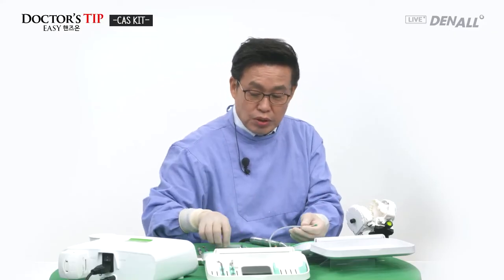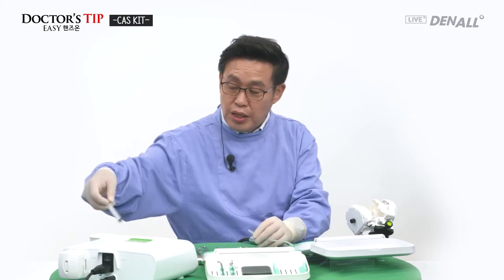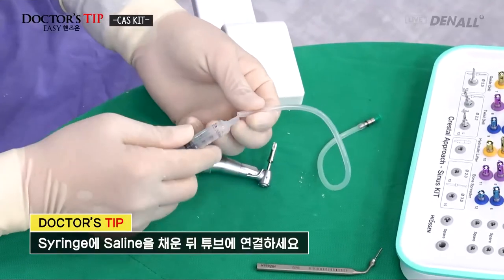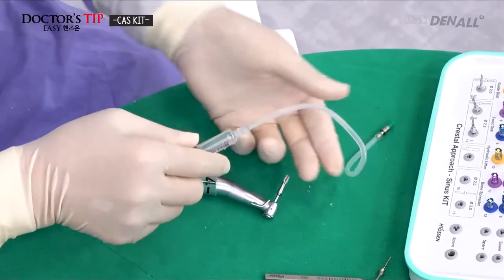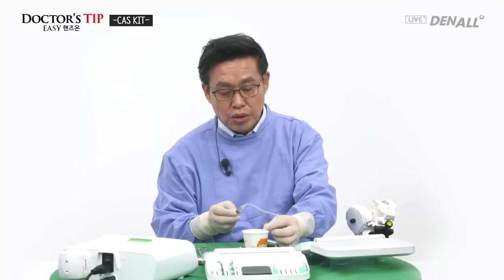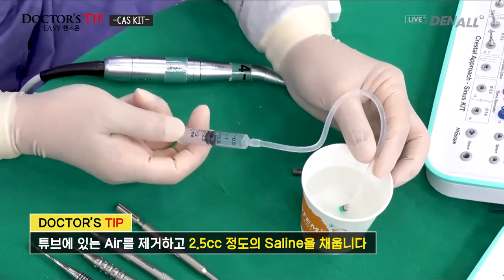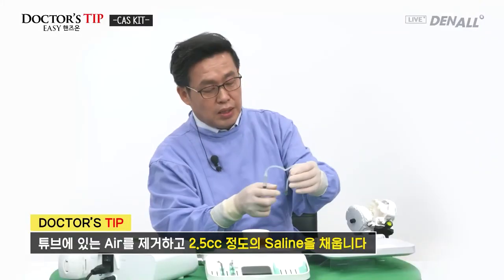Next, saline will be infused. A lot of air in the tube is not very good. So a 3 cc syringe will contain enough saline and it is connected like this. Then, if you see here, there's air inside. Saline is infused to remove the air and it is sucked out. The 3 cc syringe is filled with up to 2.5 cc saline.